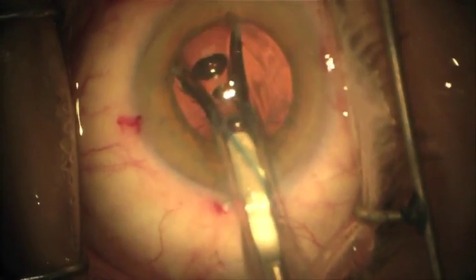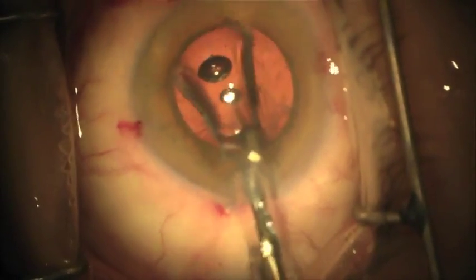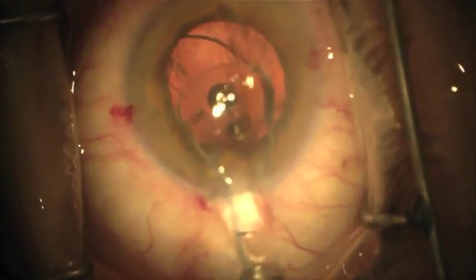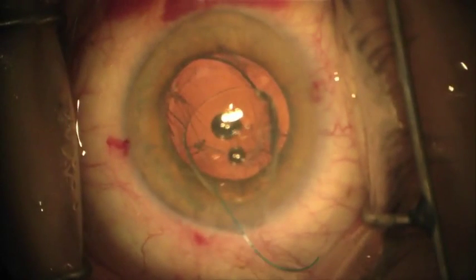Once the optic is in the eye, you will stop the injection and unscrew the injector. Continue rotating the bevel such that it is facing to the right, again in a counter-clockwise fashion. This allows the trailing haptic to also be positioned properly outside the eye.